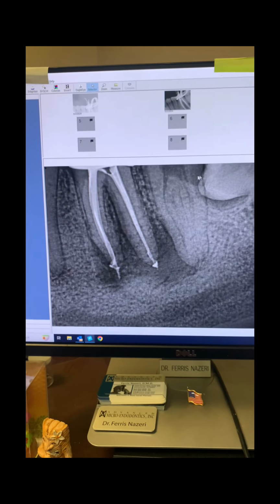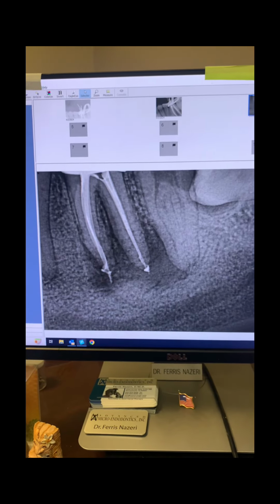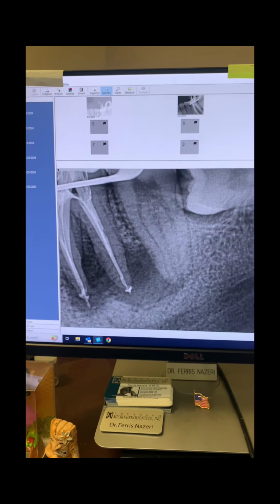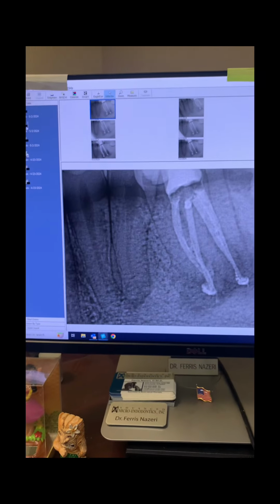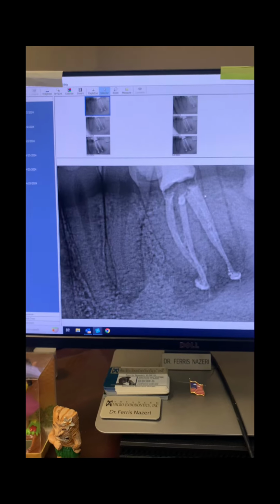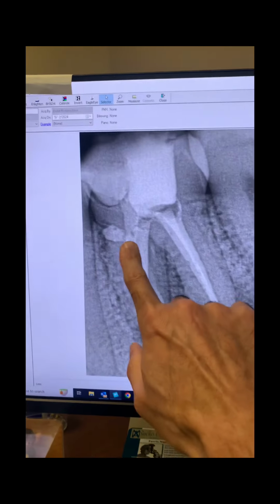In this shot I wanted a different angulation just to make sure that this wasn't sealer, and was gutta percha, and in this angulation we were able to get it. And then this angulation here just gave us a bitewing. But anyways, take a look. Here it is. As you can see, everything went beautifully.